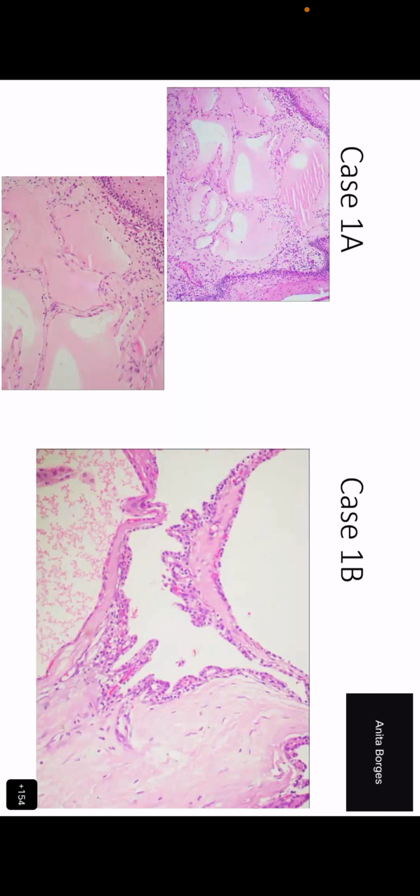In that case 1A, the cysts are lined by epithelium or endothelium? Okay. And somebody said, secondly, it's lymphatic spaces. Somebody said it is the lymphatic spaces. I assume that they think it is endothelium because it is lymphatic spaces, unless they think lymphatic spaces are just lined by something else.